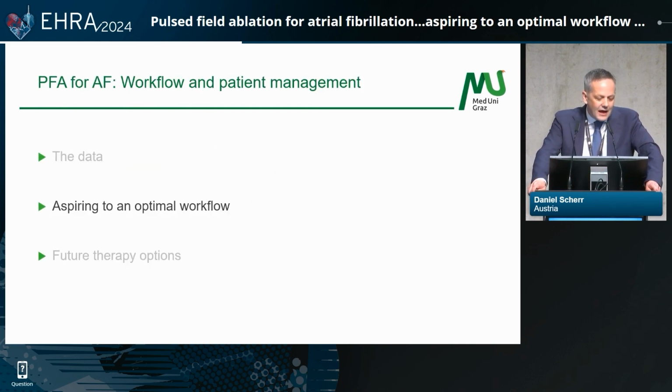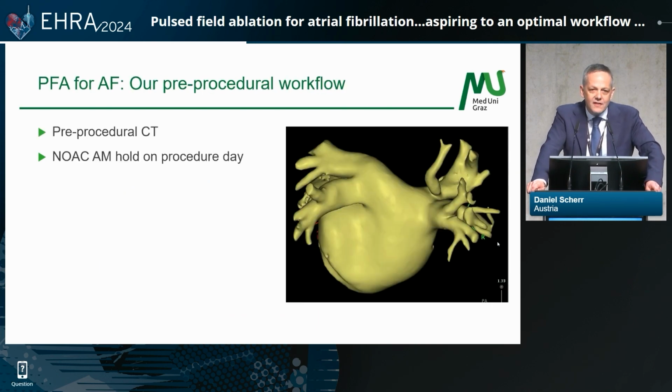Now, let me come to the workflow discussion and the way we treat our patients at our center. One of the things we still do is a pre-procedural CT, but I think any other imaging modality is fine. Some of you will use ICE, and we sometimes also do that. Some of you will do PV angios. I think it's important to use one imaging modality.